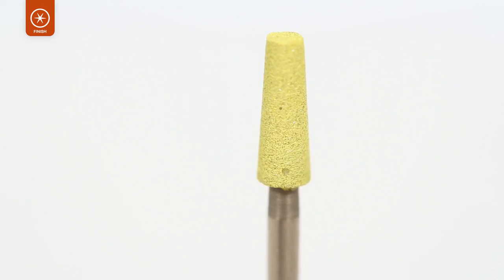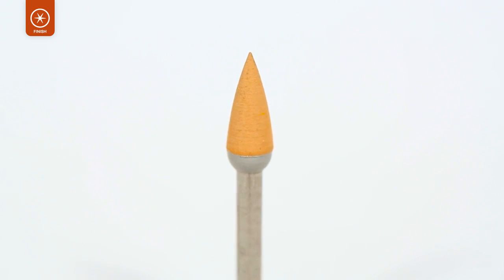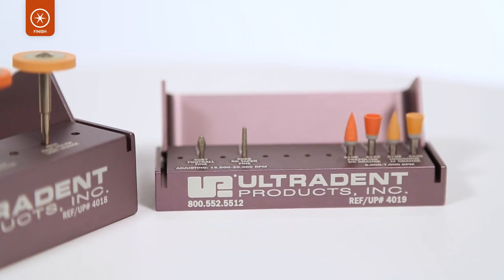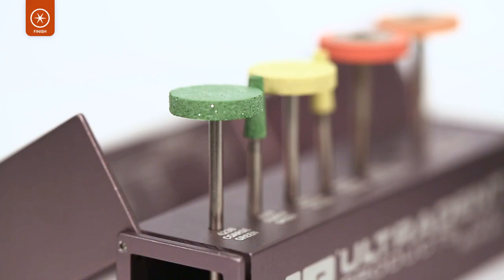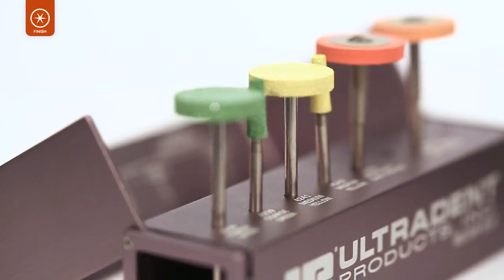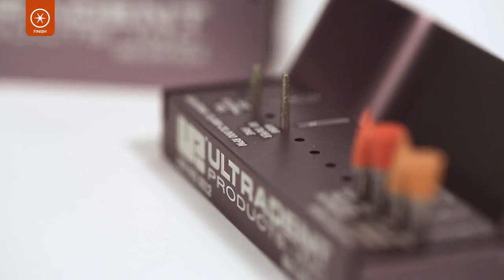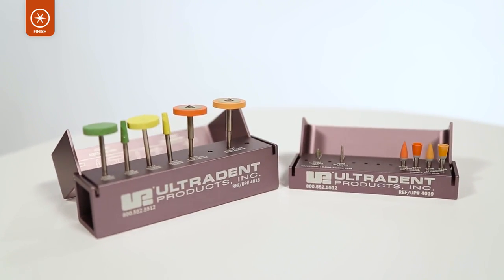Every time you finish a ceramic restoration, you know that you are creating a truly smooth, beautiful, high-gloss finish of the highest quality. The Jiffy Universal System offers a universal finishing solution with an optimal number of components. Each convenient kit includes everything you need, eliminating the need to purchase unnecessary or multiple components, saving you time and money.